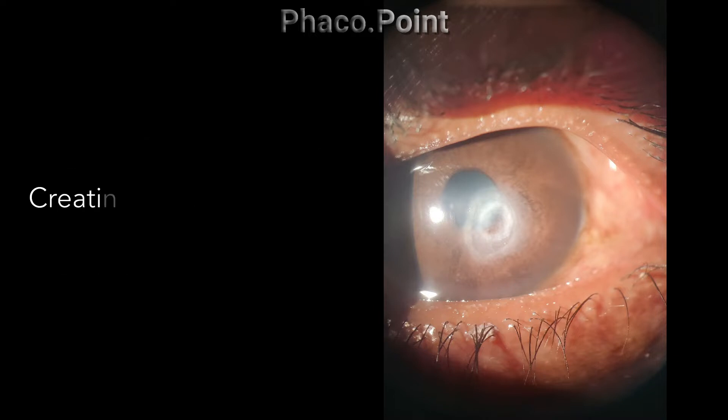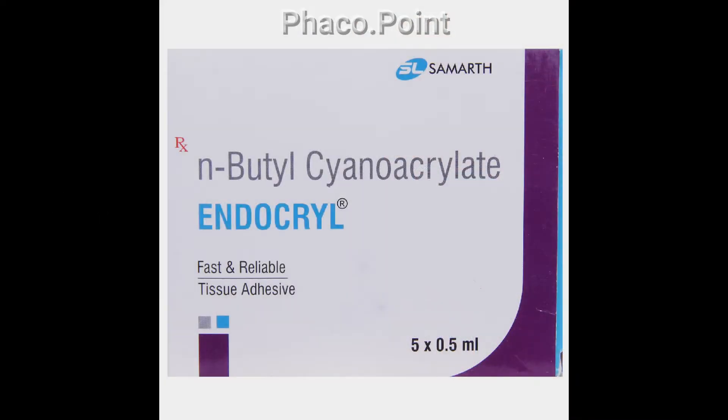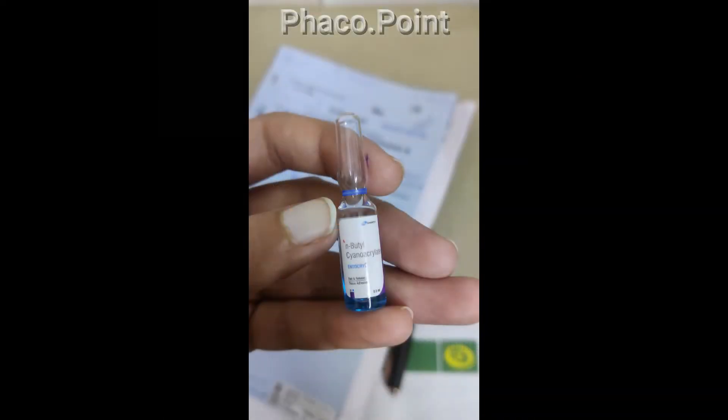If we had at hand a method by which we could create a temporary seal whilst we prepare for a more definitive surgery, it would certainly help us avoid other complications which are likely to occur. In this following video, I would like to demonstrate the use of cyanoacrylate glue as a temporary seal for localized corneal perforations.